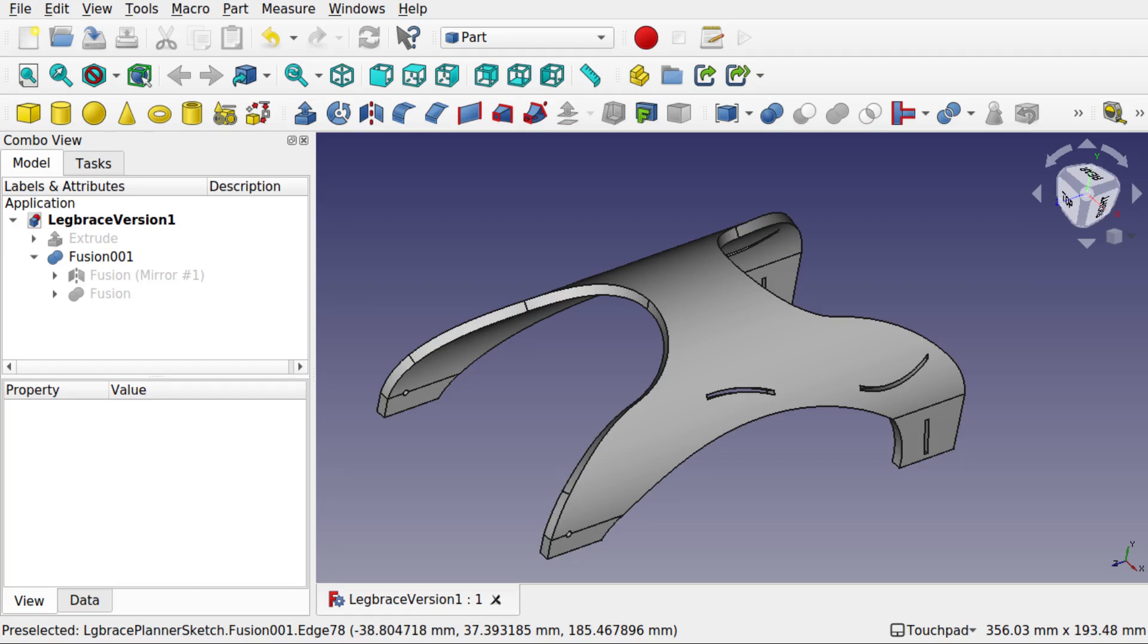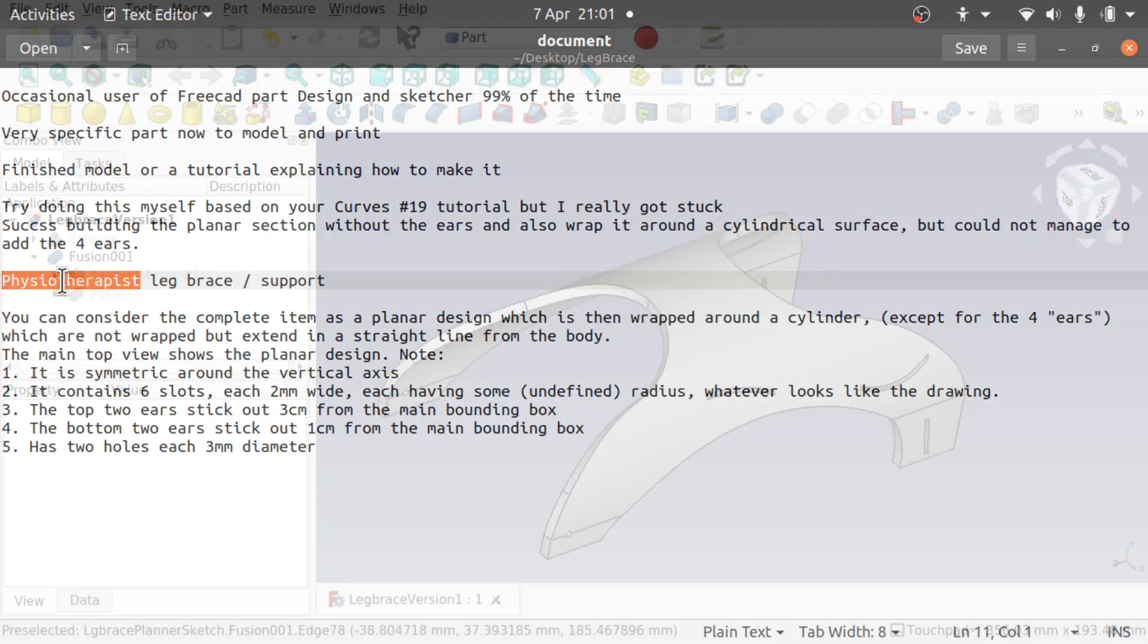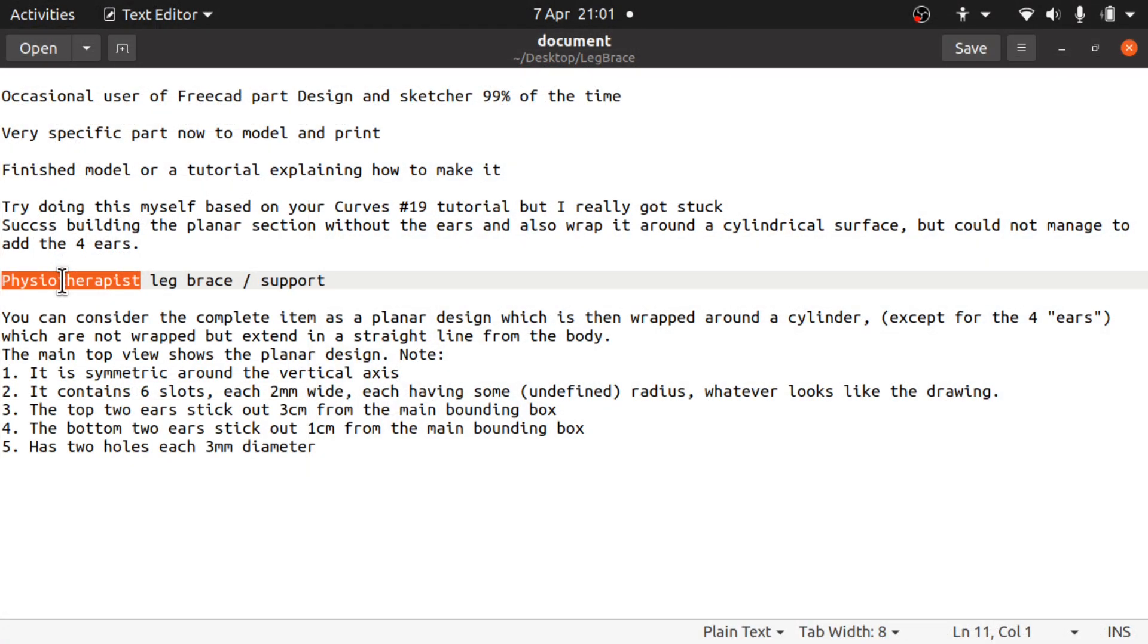Hi viewers and welcome to the channel. Today we're going to be looking at a live build project. I'm working with someone on the channel at the moment, giving them some help with the project that they're building. It's a physiotherapist leg brace for the calf muscle and we're going to be creating that in the curves workbench.